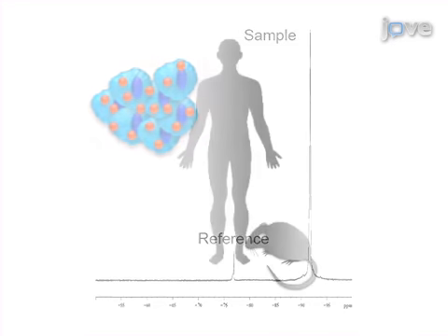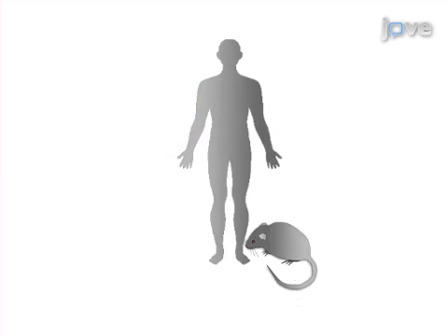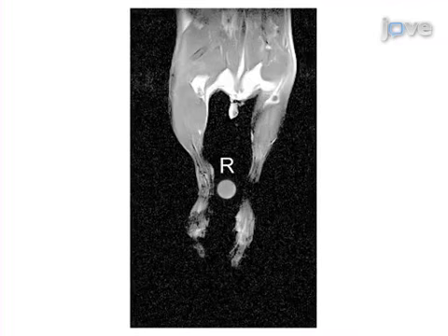Next, the subject is imaged in vivo using 1H and 19F MRI to localize the transferred labeled cells. A known reference and appropriate imaging parameters are essential for quantification from the image data.